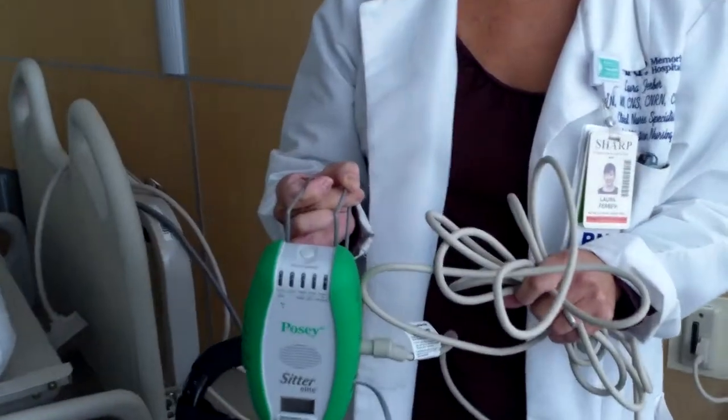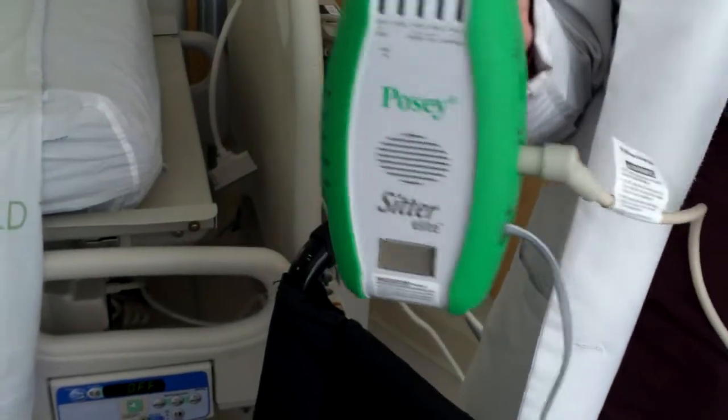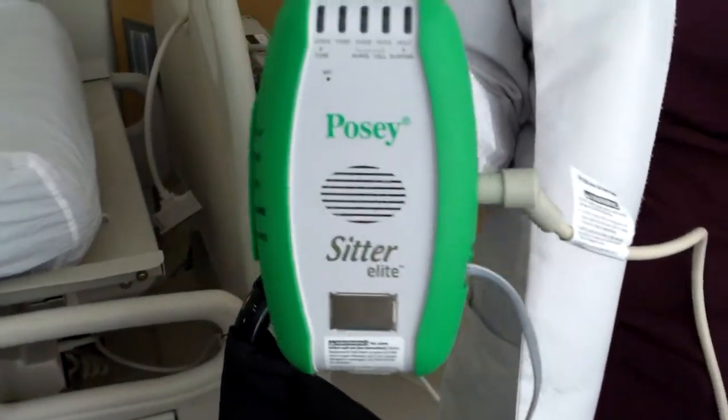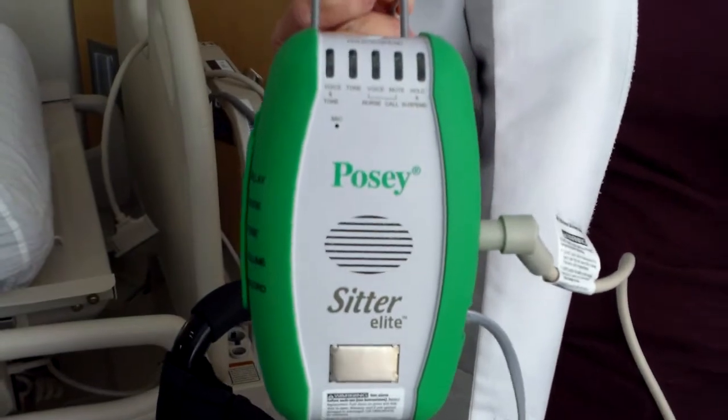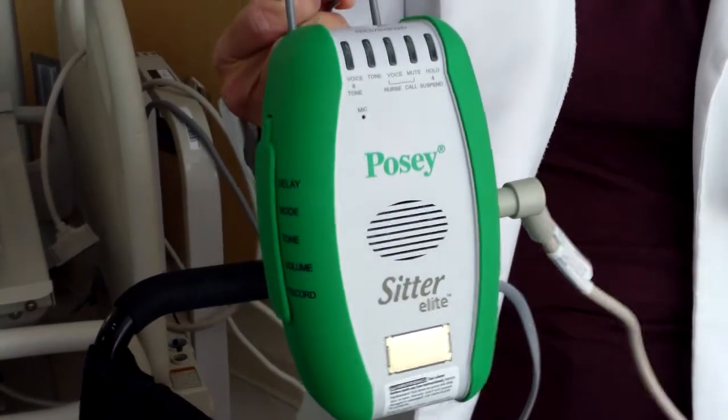So it will still alarm, but based on how big we are now and spread out, the alarms we can't always hear, especially on the day shift or on the PM shift. So this will just be our little added extra alarm.